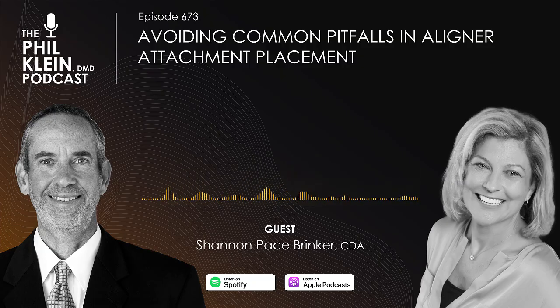But achieving optimal results requires a meticulous approach, using the right materials and techniques. In this episode, we'll cover the step-by-step process from handling the aligner template and trying it in, to etching the tooth, applying the bonding agent with precision, and ensuring proper composite loading into the template. We'll also discuss the curing process, the careful removal of the template, and the final step of detecting and removing flash for a seamless finish.